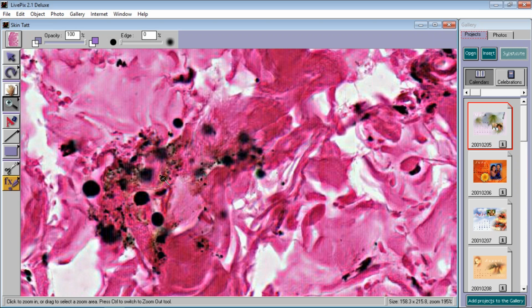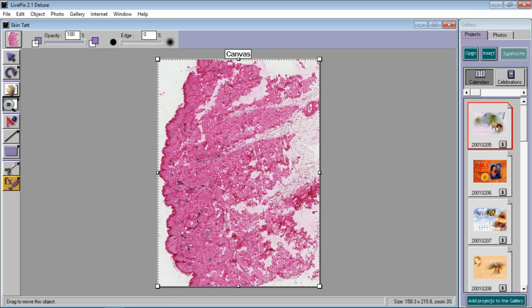Does anybody want to guess yet? It's probably something that many of you may have if you're the younger generation. This is a tattoo. This is the introduction of ink particles through a needle into the dermis of the skin, causing it to be pigmented and also grossly causing it to look black or whatever color they go in.